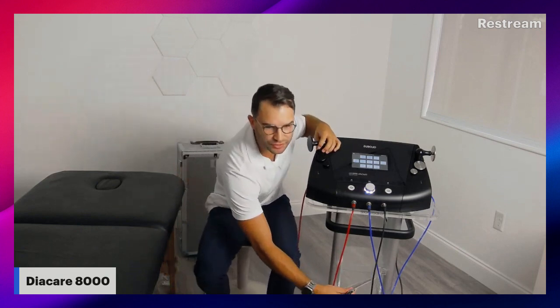Moving on, some of the most important things that I like to look at and we consider here at Globus is the geography and the placement of not only the active electrode that we have on the side of the machine, but also the return plate that is usually placed underneath the patient. So as I'm starting to set up this treatment that we're going to be doing, I want you to think about where I'm placing things and why we're doing that.